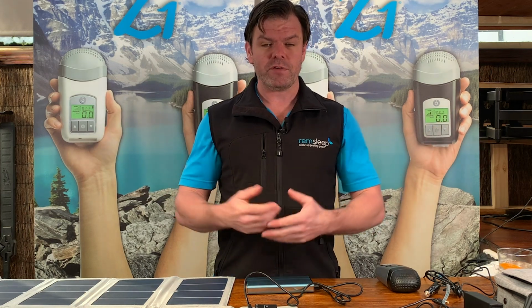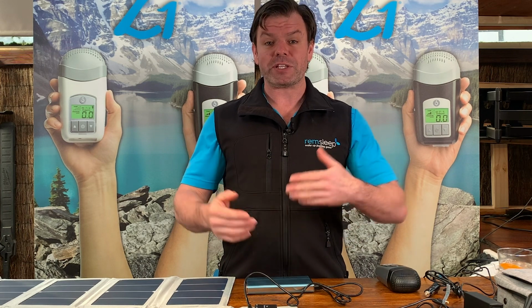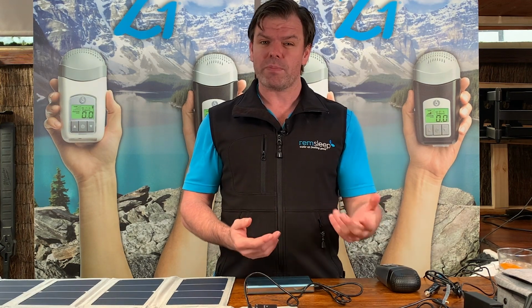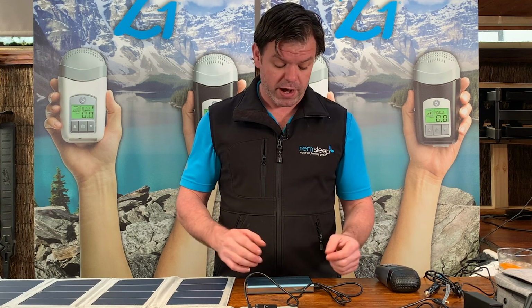But just remember that if you're doing this on a daily basis, you're not gonna have to go from flat to full. You're literally just gonna be topping up the charge. So most of the time, if you're putting the solar out there, your battery's probably gonna be sitting at halfway. So it's only probably gonna take 4 to 6 hours to charge from flat to full, which is really great.